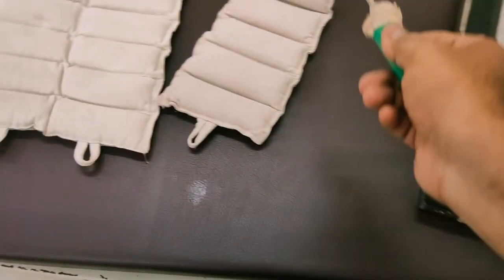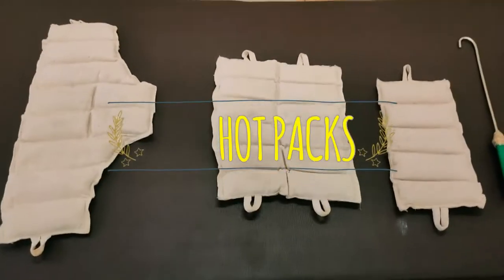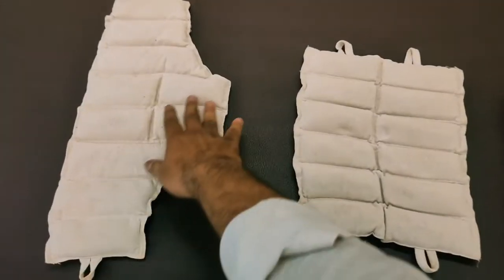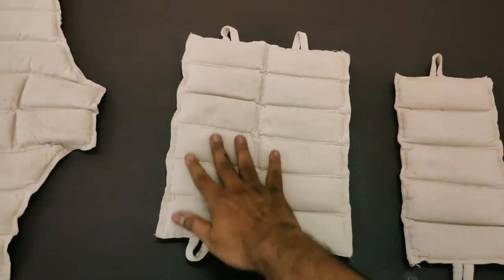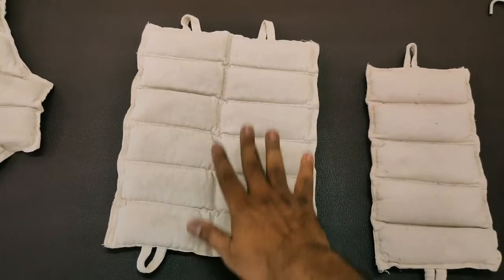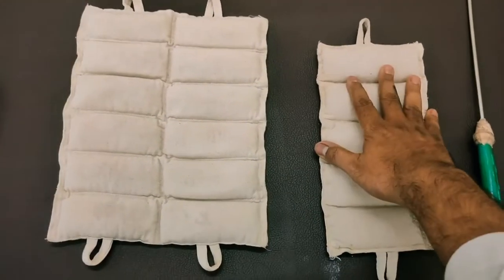These are the hydrocollator packs — they come in various shapes and sizes. This one is mostly used for the cervical area and upper back. This is a large size that can cover a large area like the pelvis, low back, or upper back. This is a smaller size, comparatively, and is used for smaller joints.